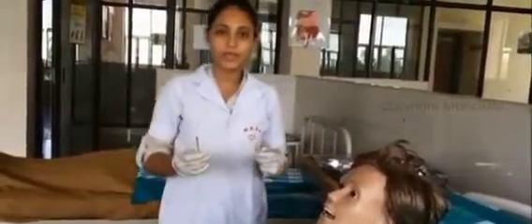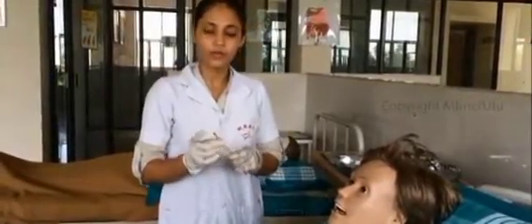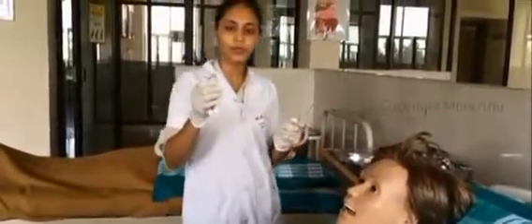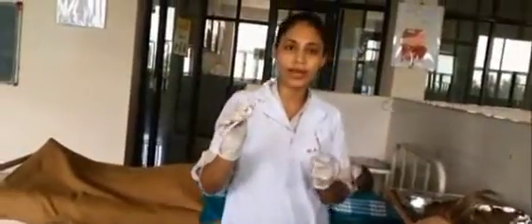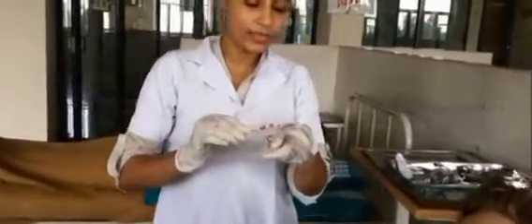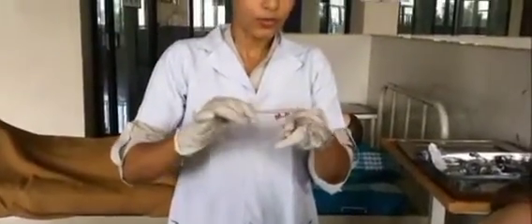So after taking the measurement of the NG tube, before introducing it, first we have to lubricate the tip of the Ryle's tube. The lubricating jelly will be there. We can open it, and sometimes before the procedure some contamination or hard things will be there, so some portion we have to discard into the kidney tray. Then we keep it on our palm and lubricate it. Now we have to lubricate the tip, that is 5 to 6 centimeter.